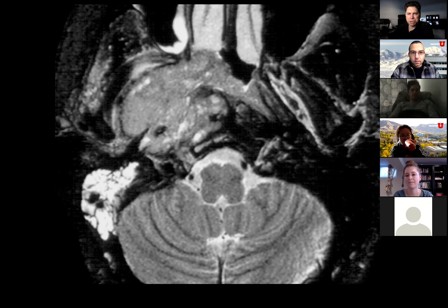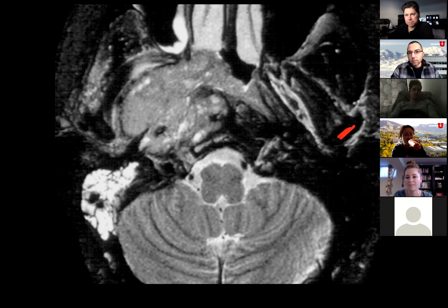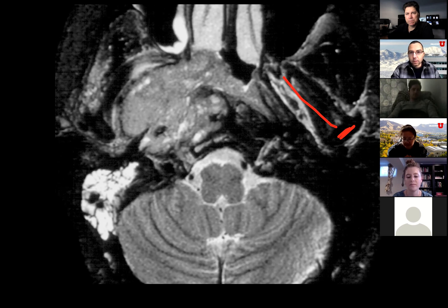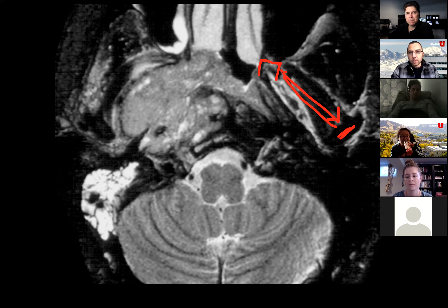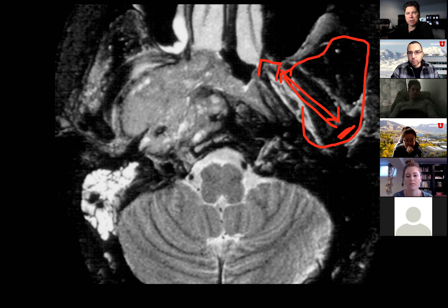What is the masticator space at this level? That's the mandible — the condylar head. These are the pterygoid plates, and from the lateral pterygoid plate to the condylar neck is the lateral pterygoid muscle. So that's the masticator space around there.